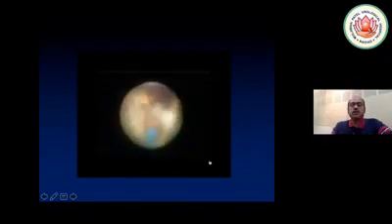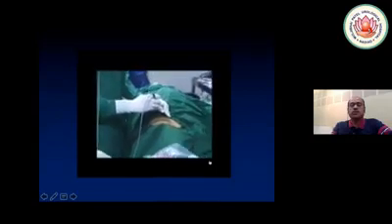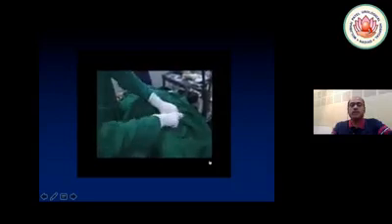The fluid irrigation was under pressure, and the ureteric catheter which we put in the micro PCNL is end multiple hole, and it keeps on draining the fluid outside, the fluid which is coming in the ureter. So this way we can see the whole pelvis and the stone completely cleared up. This is how the fluid from the pelvicalyceal system keeps on draining. And once we confirm on fluoroscopy and endovision that the whole stone is completely cleared and dusted out, this is just a puncture mark you can see.